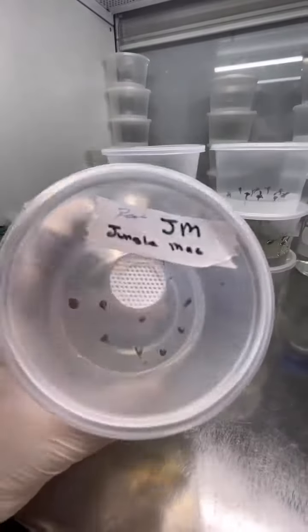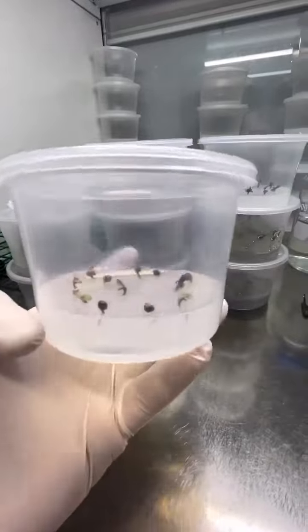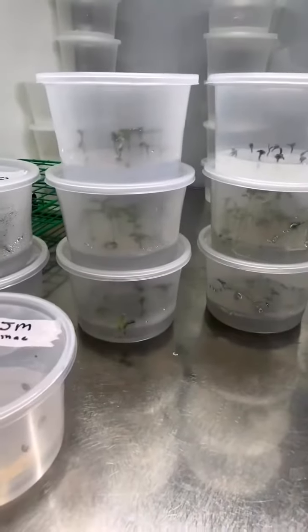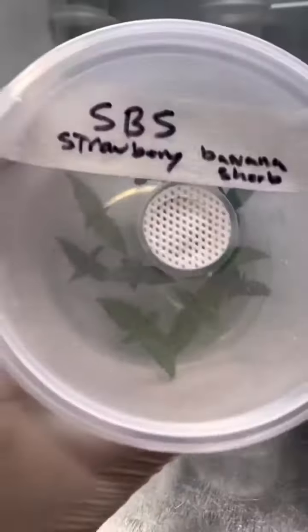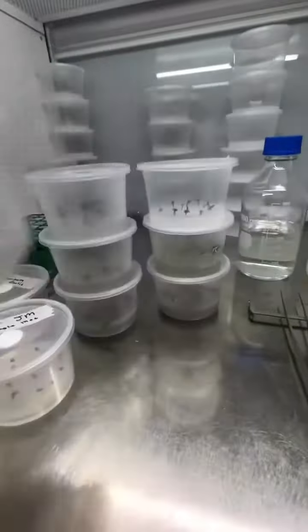Here I have all of my seeds in culture — very simple and easy to keep. Lots of strains in one area, very compact and sterile. I can basically keep them here and utilize them until I'm ready for them, pull them out as needed. It's a great way to keep everything in a small contained area so later on I can decide what I'm going to do with them.